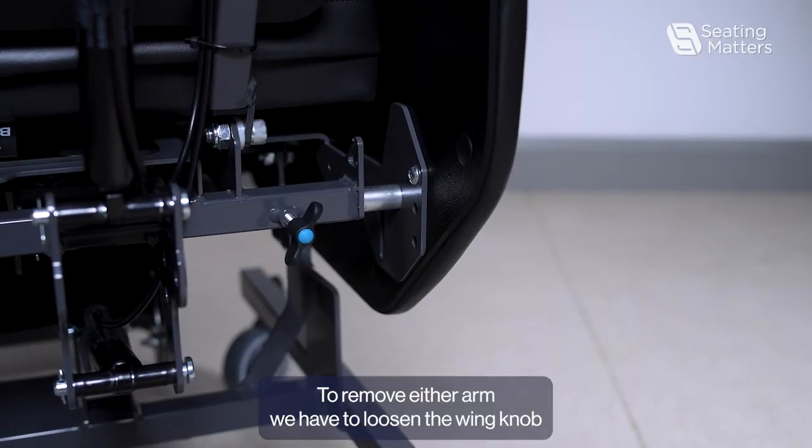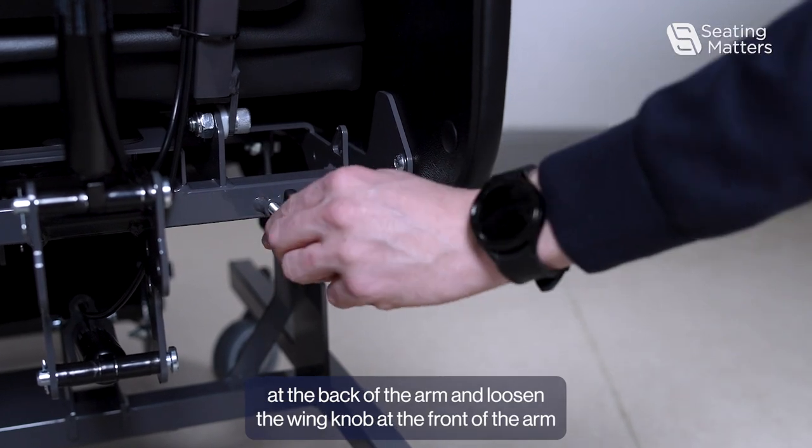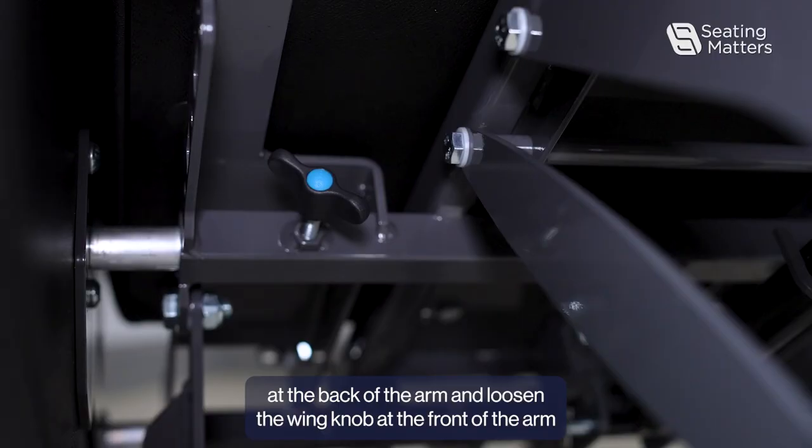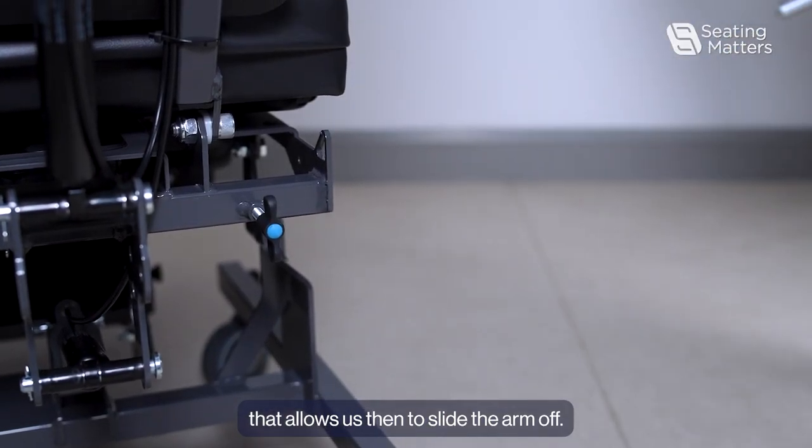To remove either arm, we have to loosen the wing knob at the back of the arm and loosen the wing knob at the front of the arm. That allows us then to slide the arm off.